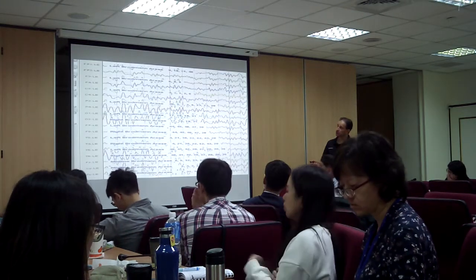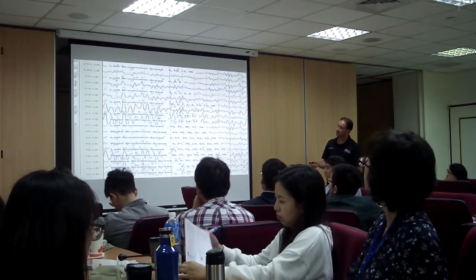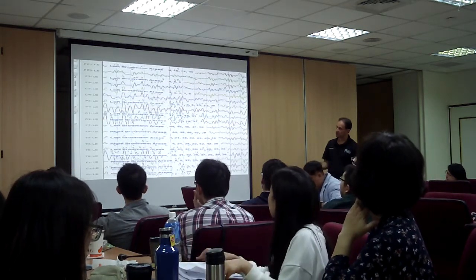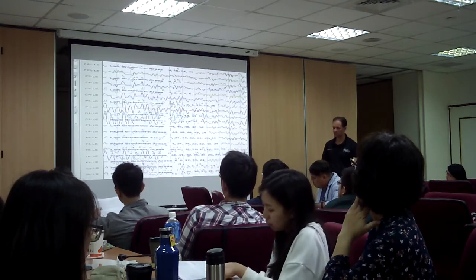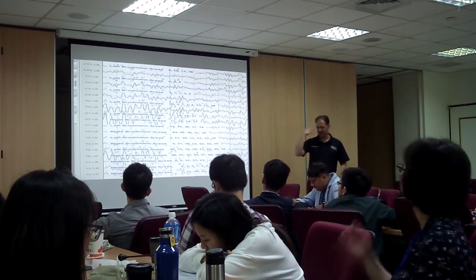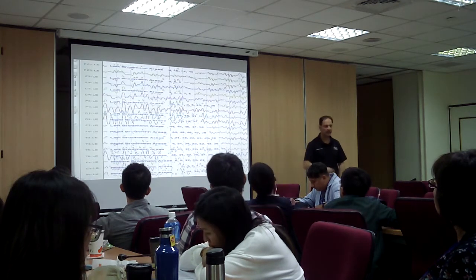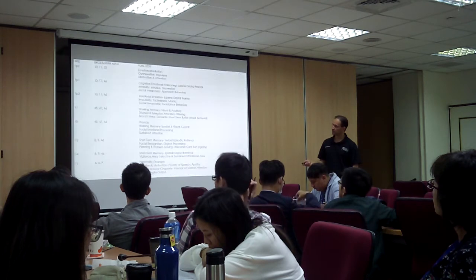And here's a nice one. So here you have your F1 and you have the Brodmann areas. You have F3 and you have the Brodmann areas. So this is a good breakdown of Brodmann areas by size. So maybe you can print and make a big poster out of this one. It's a very useful chart to use. And then again, the more you do it, you're not going to need to refer to this anymore because it's just going to become second nature. It's like tying your shoes or driving a car. It's just going to be there.